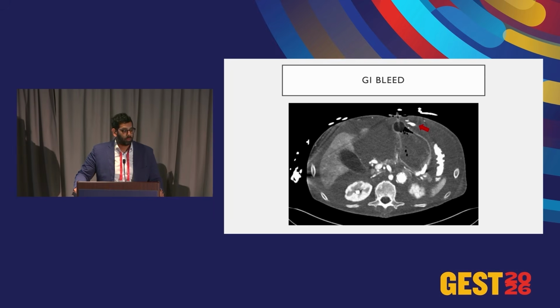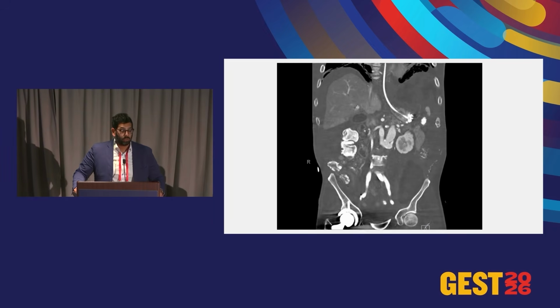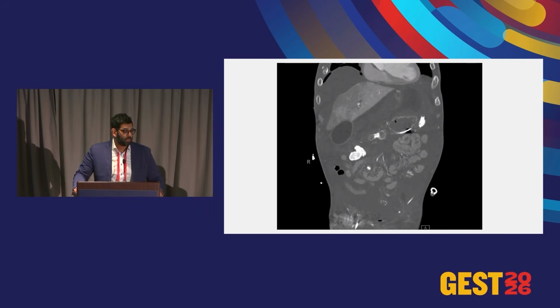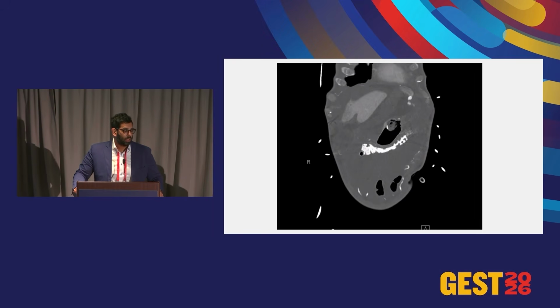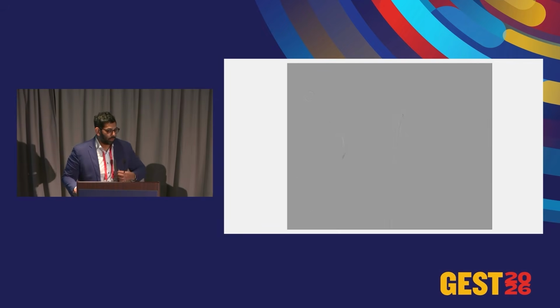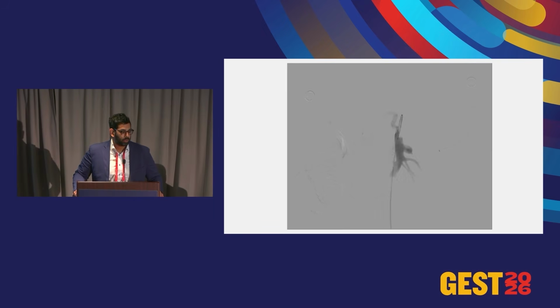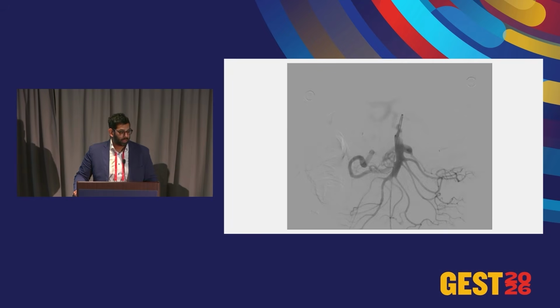So my plan was to actually take down the left gastric and/or the gastroepiploic. The challenge was for this particular patient, as we rolled through this coronal scan, he had a history of a coarctation of his aorta and a bypass graft, and he had no celiac artery origin. And you see a very, very large SMA collateralized to take over the celiac, and you see the blush here anteriorly, sorry, right next to the G-tube balloon. So not the most straightforward catheterization. This was the initial arteriogram. You see the well-developed pancreaticoduodenal arcade to the GDA, very tortuous, supplying that entire territory.